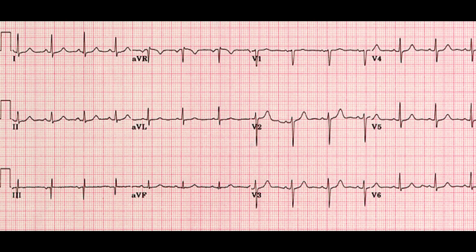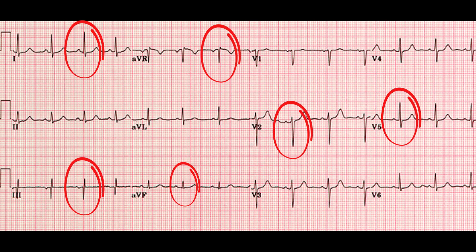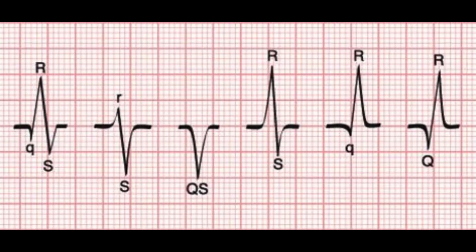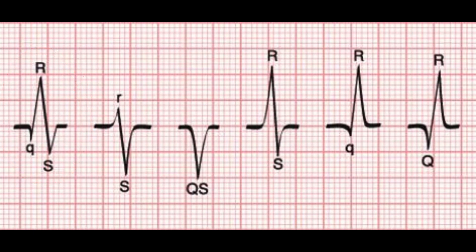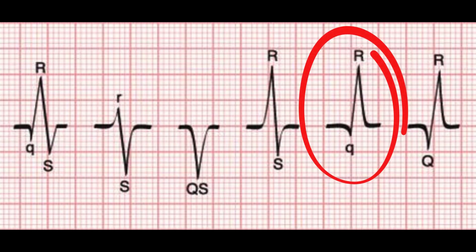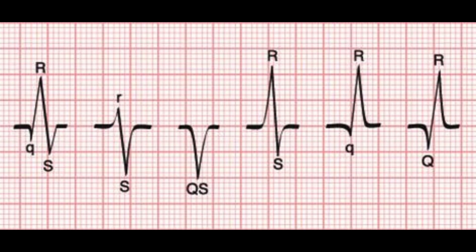If you look at this 12-lead EKG, you will notice the normal QRS complex variations in each of the leads. In this illustration, these are the common QRS complex variations. You can have the regular QRS complex, an RS complex which lacks the Q wave, a QR complex which doesn't have the S wave, or a QS complex which doesn't have an R wave.